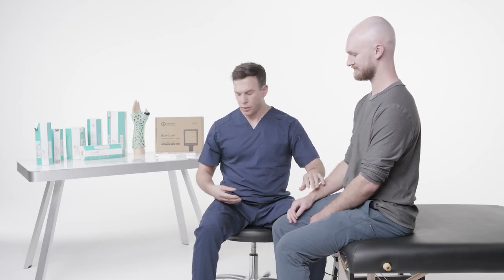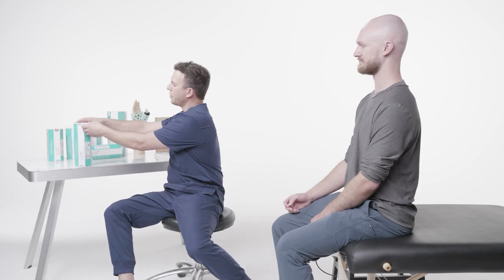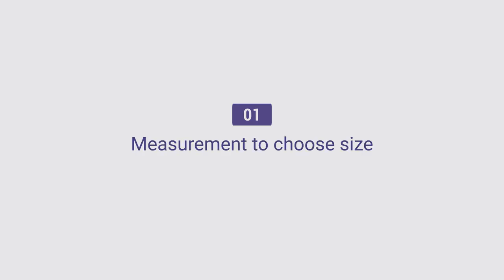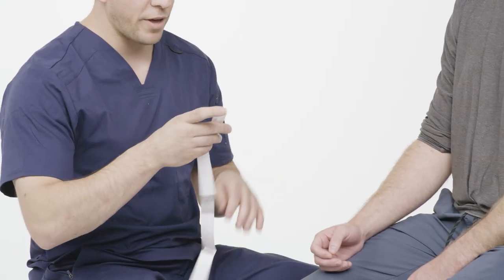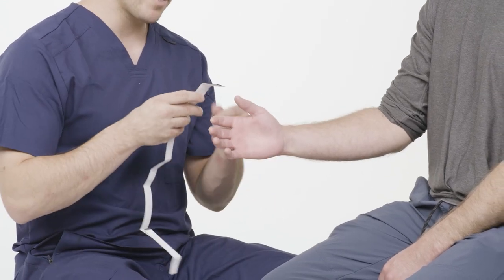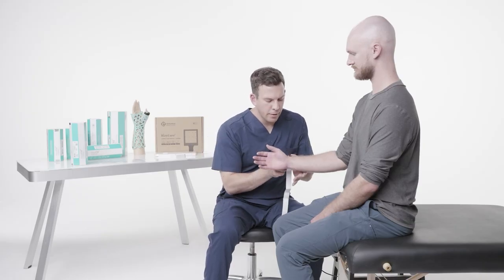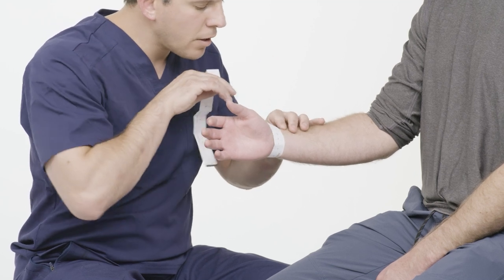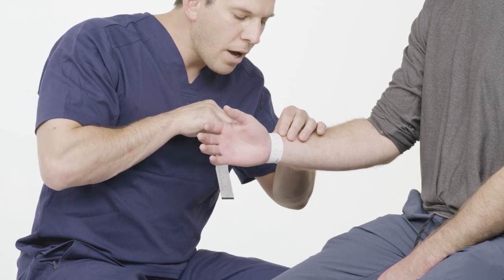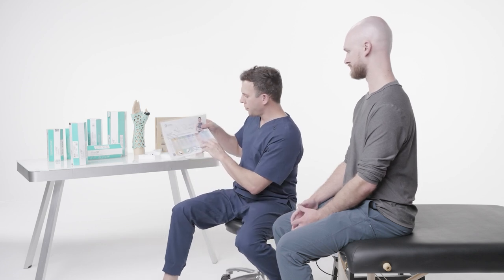The first thing I'm going to do for my patient is get a measurement — I need to figure out what size my patient is going to need for the Thumb Spica. I'm going to take the T-Measure from the box. Every OrthoHeal box comes with a T-Measure, and I'm going to measure his wrist circumference. I'll wrap it around the wrist — he has roughly a 17-centimeter wrist, so that's about a medium according to the chart.